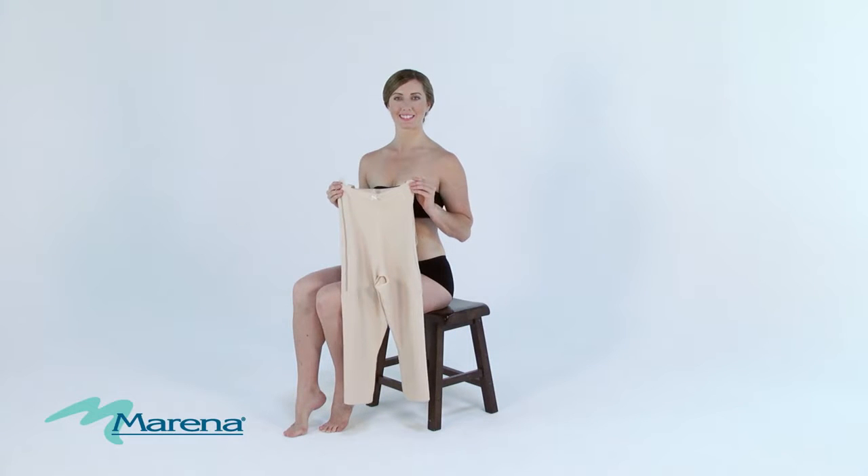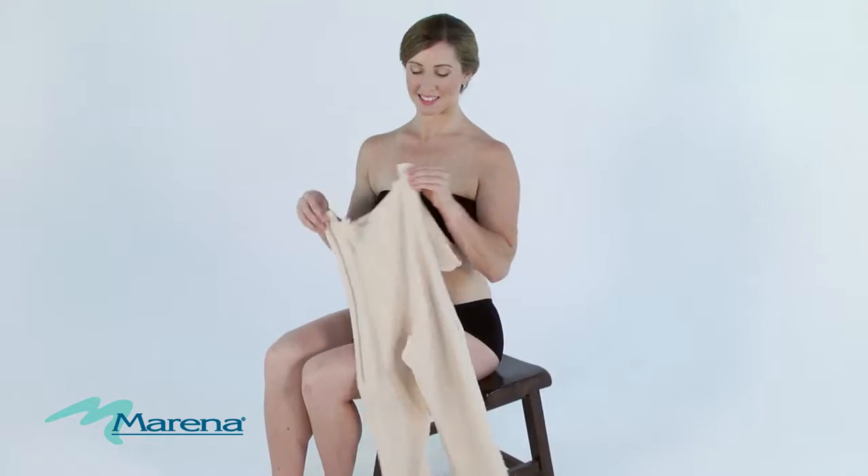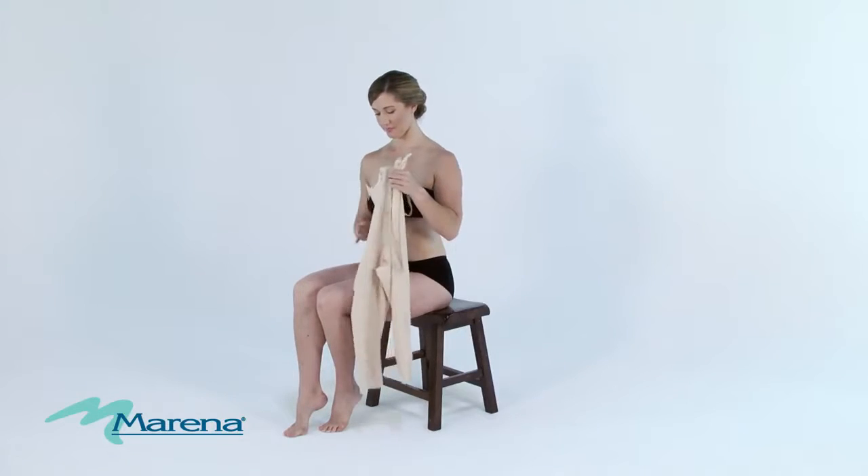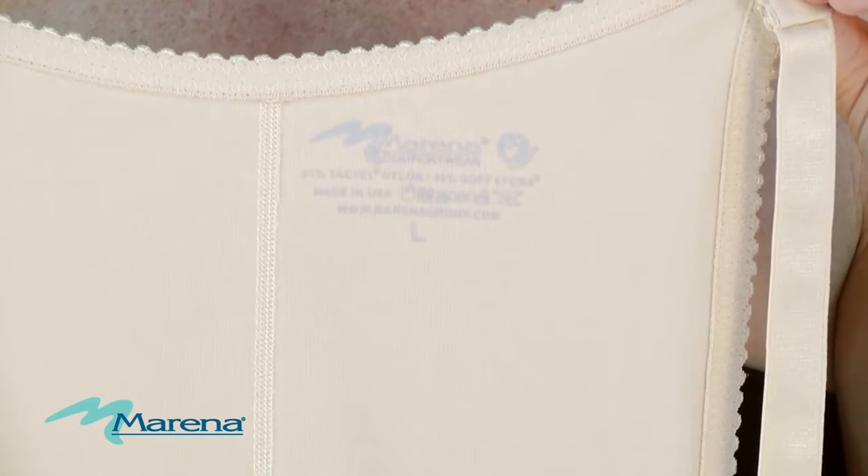We'd like to share with you how to extend the life of your compression garment and assure the proper fit. First, open the garment completely and make sure the sizing label is in the back on the inside of the garment.